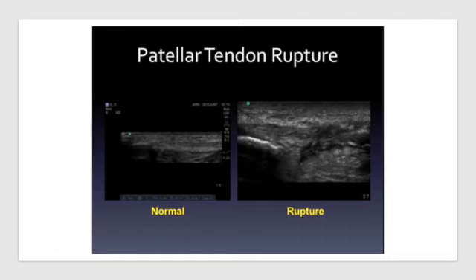So again, this is that patient that comes in, I fell down, holy cow, I think I maybe messed up my knee. Let's fire up the ultrasound and let's take a look at it. But again, you've got to know your anatomy here, really have to know what you're looking at. But I will tell you, with some practice, we as physical therapists are very well equipped to perform these sorts of images.